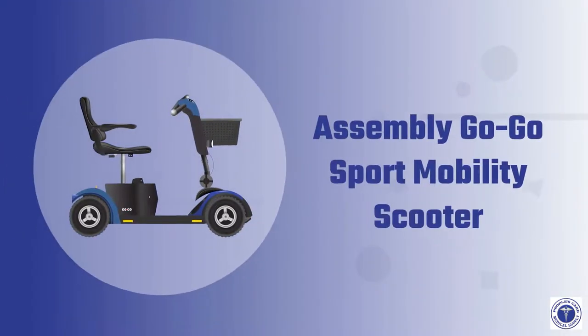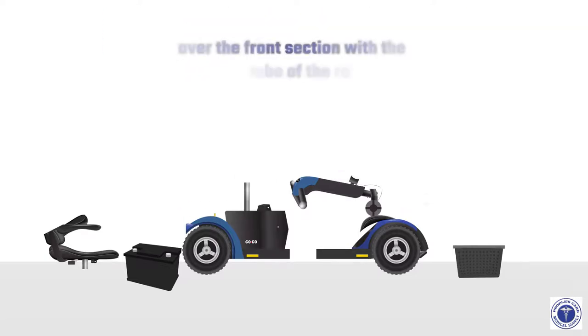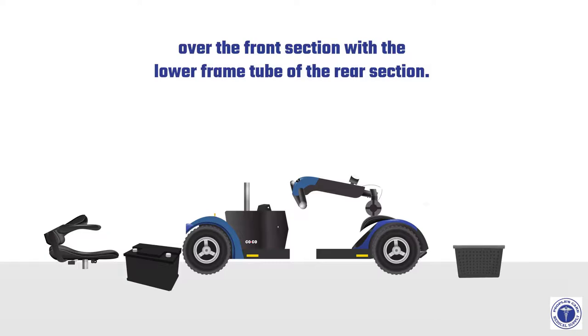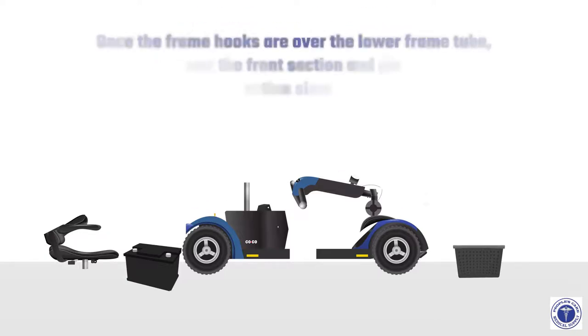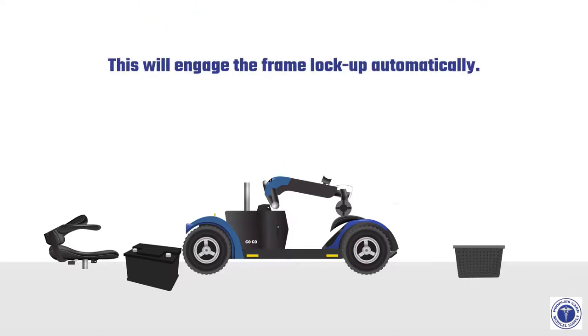To assemble the GoGo Sport Mobility Scooter, use the frame release lever to lift the front section as you align the frame hooks over the lower frame tube of the rear section. Once the frame hooks are over the lower frame tube, lower the front section and pivot the rear section simultaneously. This will engage the frame lockup automatically.